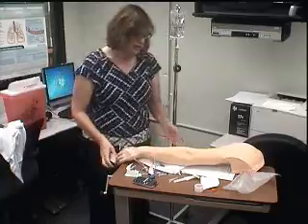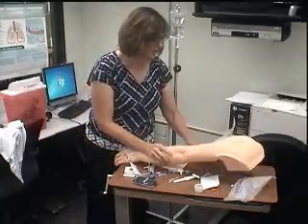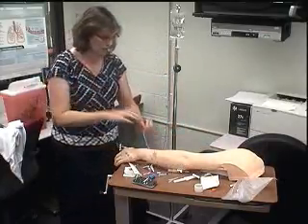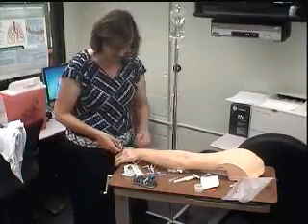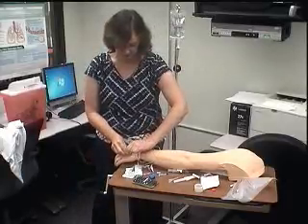All right, so then, like I said, part of your checkout is that you need to discontinue it. So what do you need to do to discontinue it? Well, you want to make sure to stop your IV fluids, as soon as you don't want those flowing. Well, if you have a saline lock, just lock the saline lock. You can get rid of these fluids.